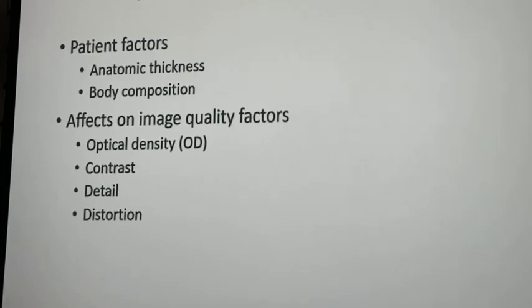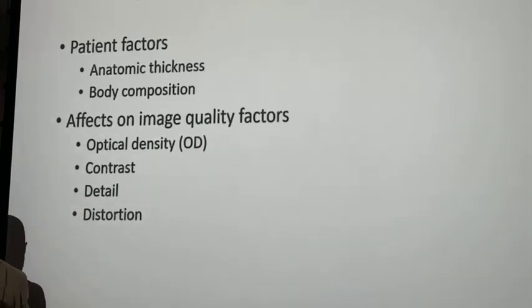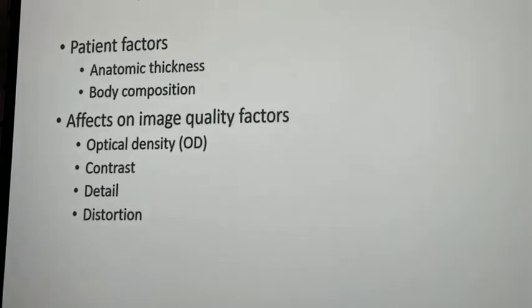Okay, so in the contrast, the reason I took that rabbit trail is because in the contrast, you've got two different things. You have to have that differential absorption. You have to have it, or you have no contrast, right? But the contrast as displayed is dependent not so much on KVP, but rather on that computer algorithm and that stored histogram inside of the computer that we call the lookup table.